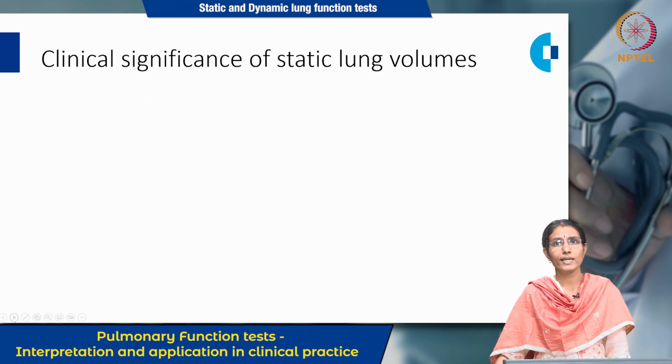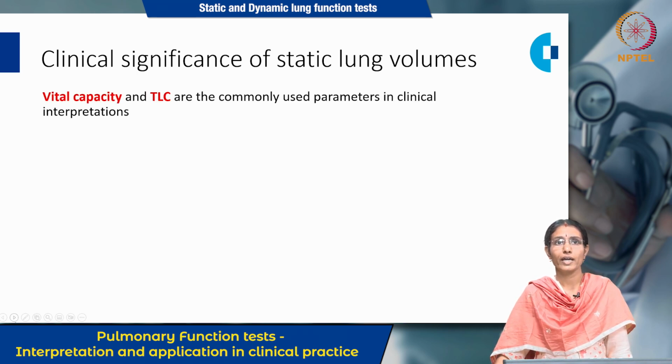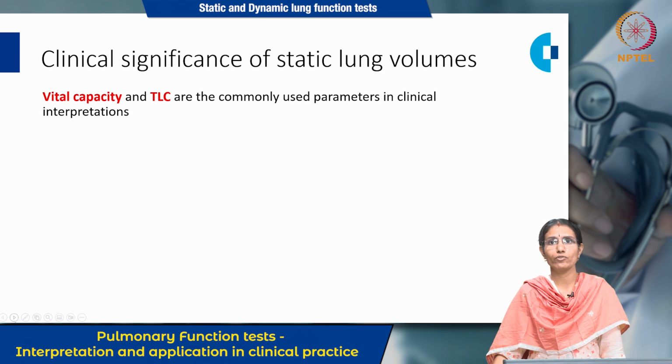Now, what is the clinical significance of these static lung volumes? Why do we have to do these tests? They have a clinical significance. So, what is the clinical significance and which are the parameters which are used for clinical interpretations? Especially vital capacity and total lung capacity. These are very important parameters which are used in clinical interpretations.